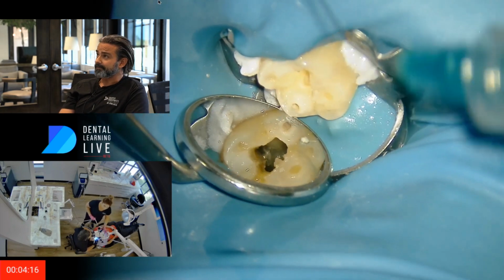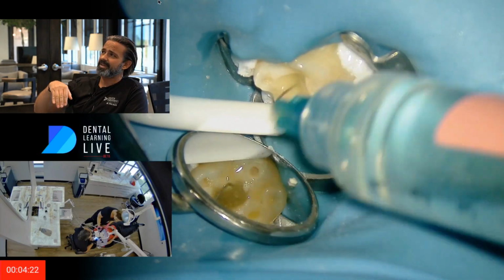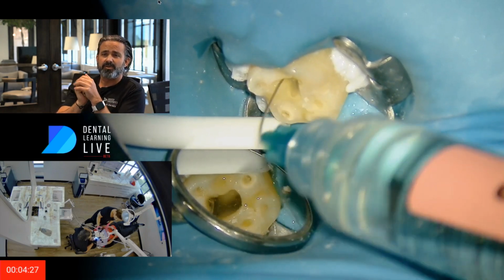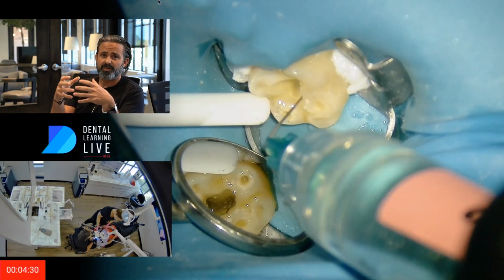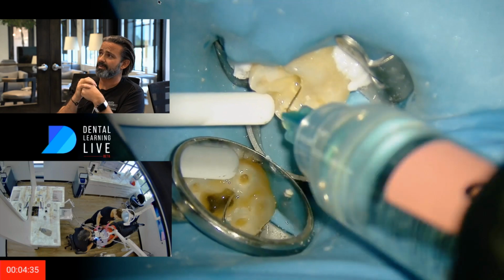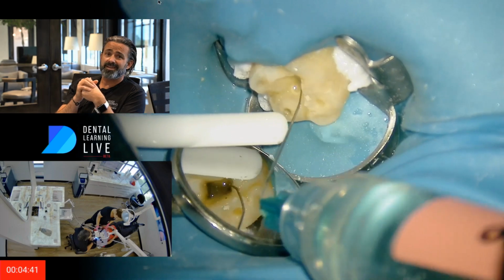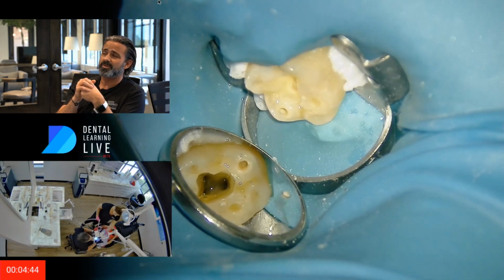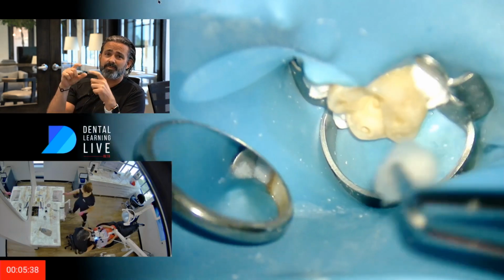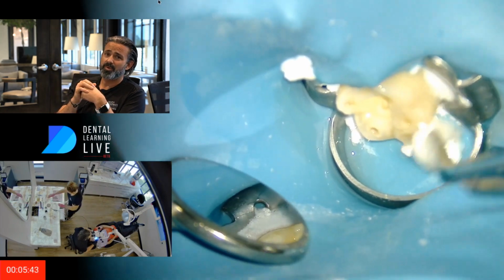If I'm getting confident that it's not decay, and I'm very suspicious of it, that's something I have to think about in the GentleWave procedure, because I need to maintain that sort of closed seal in order for this technology to work. And we'll go through that technology, by the way. Now that I've filed into this thing, I'm just hand irrigating sodium hypochlorite. I use a basic syringe and a 30 gauge Max-i-Probe tip, and I label them all. So if you paid attention, I labeled that to say sodium hypochlorite.